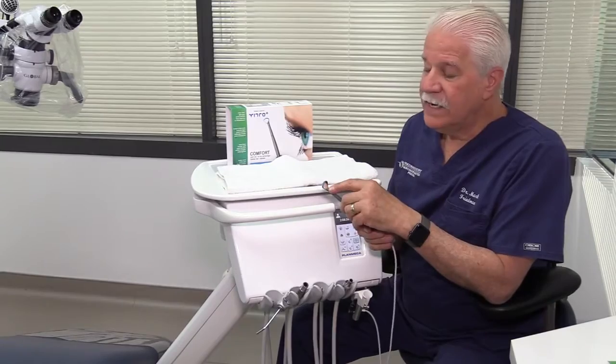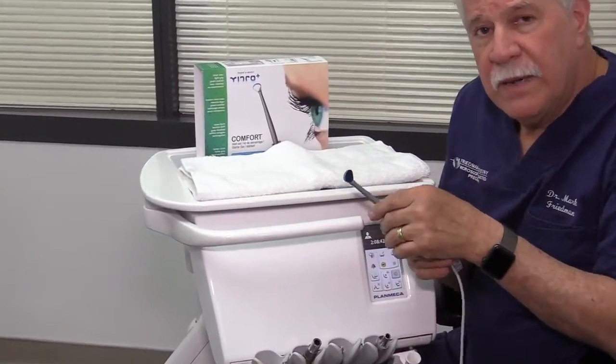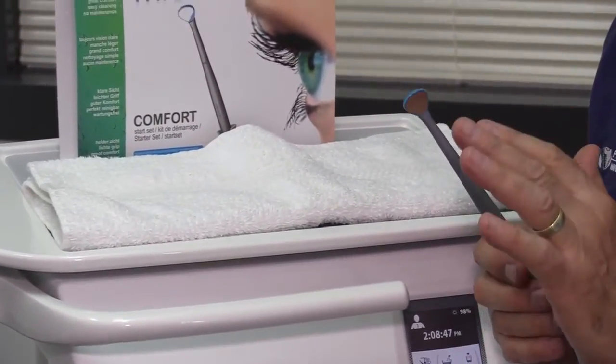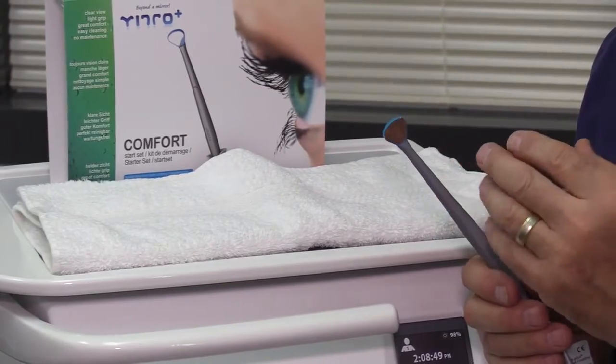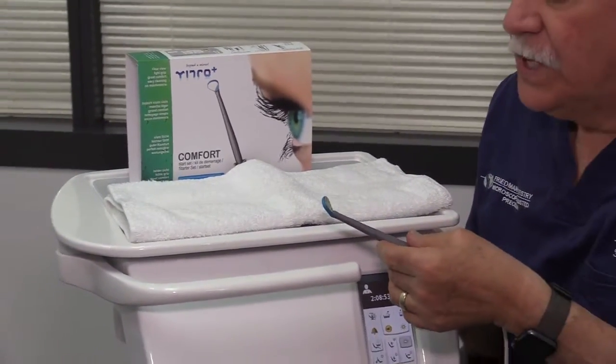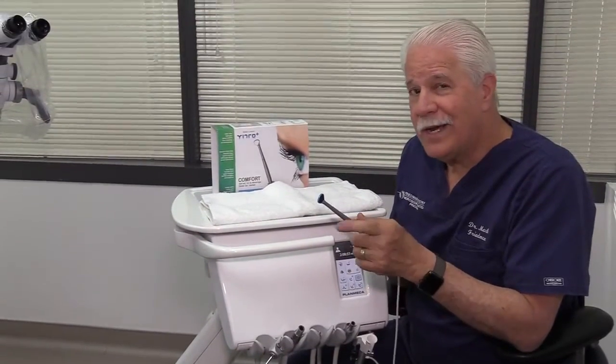This tiny slit causes a laminar airflow to shoot across the mirror and keep it clear. These are really high-quality surface mirrors. They even have a system for putting the mirror away so that it doesn't get scratched during disinfection and autoclaving. It's a well-thought-out system, and the proof of the pudding — we're going to try it here in just a moment.